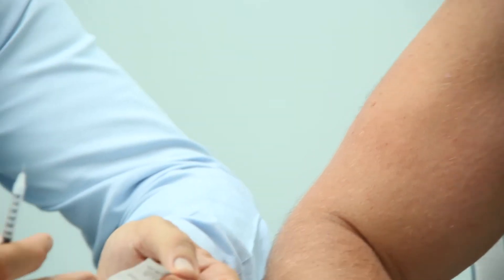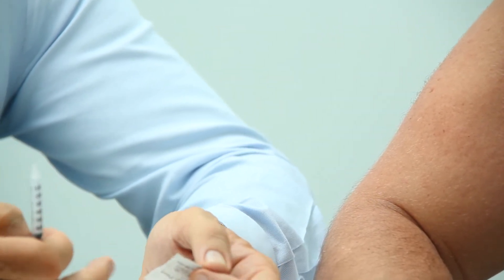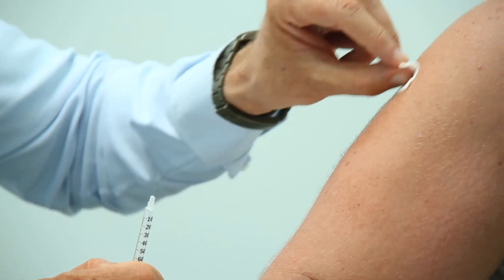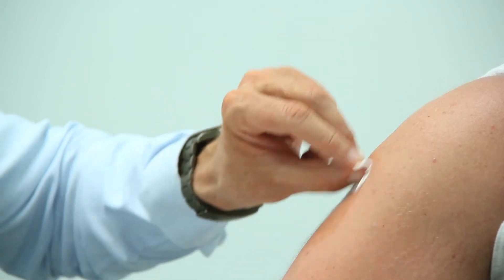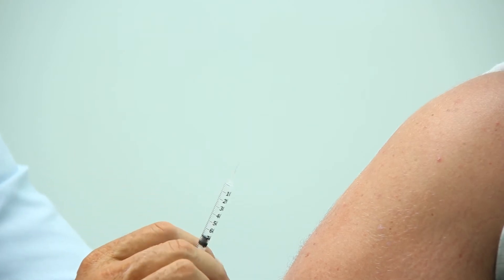This is a subcutaneous medication — it can go in the belly, can go in the arm, can go in the thigh; it just really needs to go beneath the skin. Today we're going to do it in the arm. You're going to want to clean this area with some alcohol first, just to keep the site of injection nice and clean. Let that alcohol dry for a few seconds so it doesn't burn when we inject.